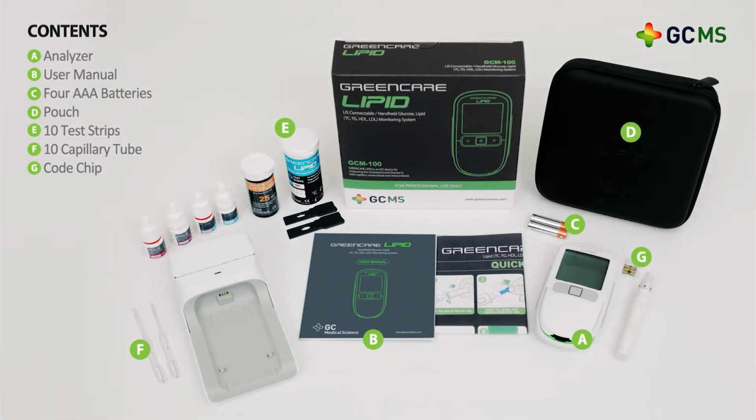The test kit can be stored at room temperature, 2 to 30 degrees Celsius, for up to 12 months from the manufacturing date. There is no need to refrigerate the test kit. The strip can be stored for up to 3 months after being opened.